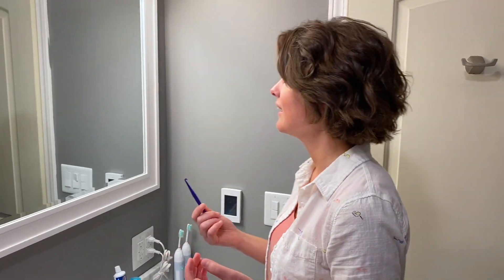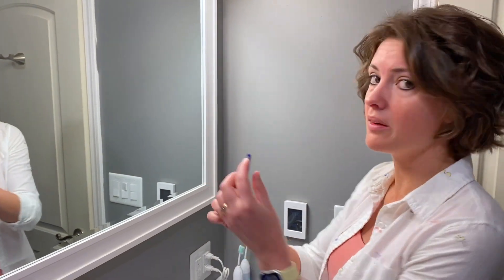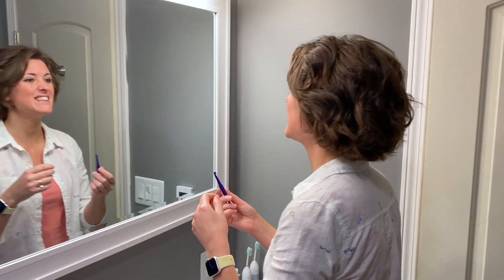I watched a YouTube video — doesn't mean I'm going to be as successful, but we'll see what happens. So apparently the one with the little hook, like this, that's for your top teeth. This one is for your bottom teeth. We're going to try the top teeth first, just to see what happens.